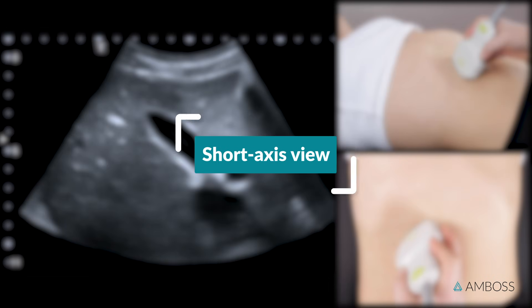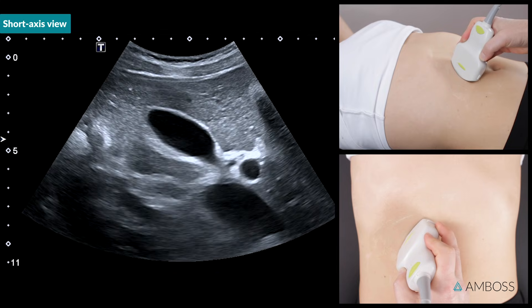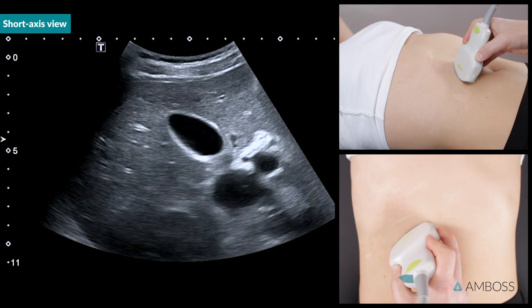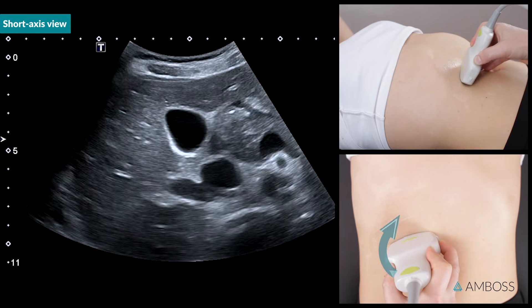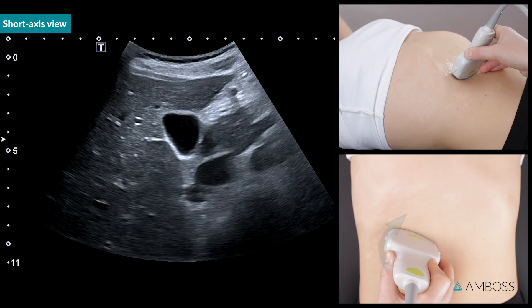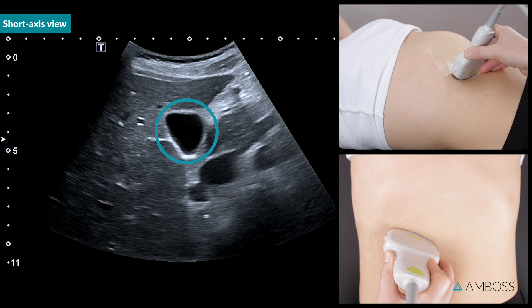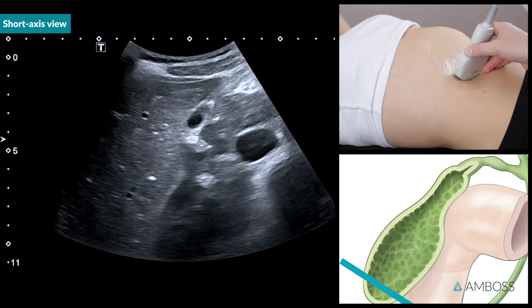Short axis view. To obtain a short axis view, rotate the probe 90 degrees. The probe marker then faces towards the patient's right side. In this view, the gallbladder has a rounded appearance. Keeping the probe orientation the same, slide the probe along the gallbladder to scan through it in short axis view.